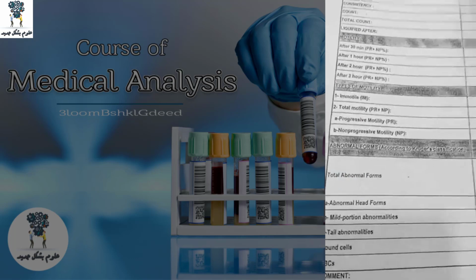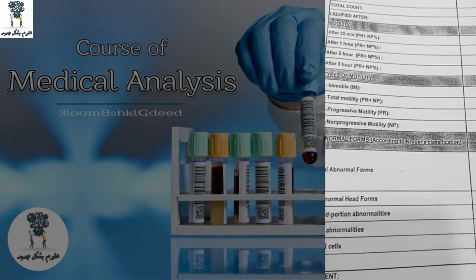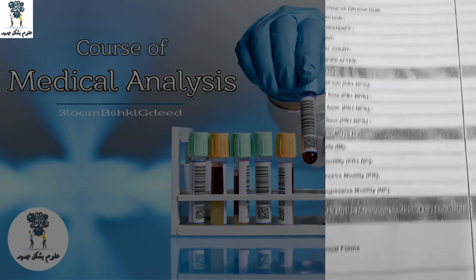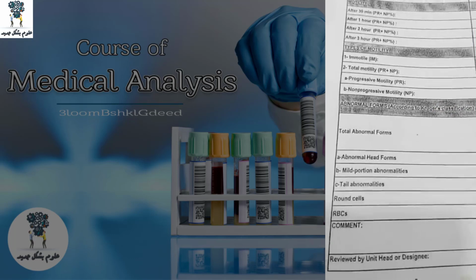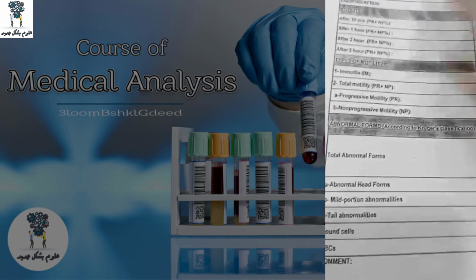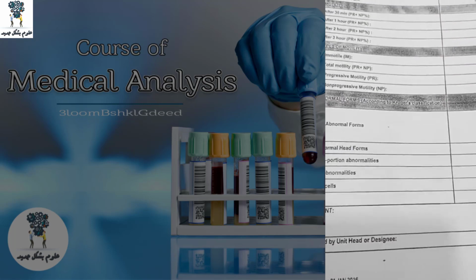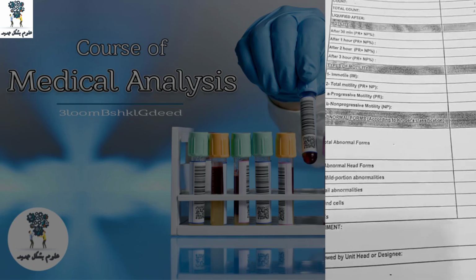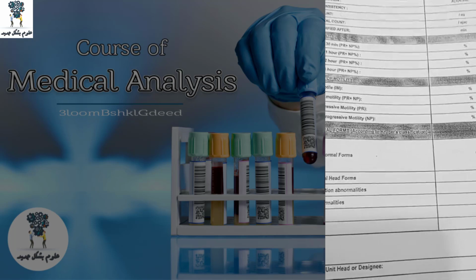ما it's not a problem ان انا اشو numbers، لا المشكلة ان انا بكتب بعمل حوالي زي نوتس للدكتور بان انا اد تيست لكل نوتس عندي. يعني انا كأني في محطة، يعني انا بوصل لمحطة اللي بعدها محطات لغاية اوصل الاند عندي نورمال بس اوكي التحليل بتاعك كويس، مش نورمال بقى هنت بقى، يعني بعمل هيدلاينز لكل حاجة وبكتب لها الكومنت بتاعها. وده الستاندرد في WHO، وده تقدروا ان انتوا تدخلوا عليه على الويب سايت بتاع ان انتوا تكتبوا Semen analysis reports standardization WHO.